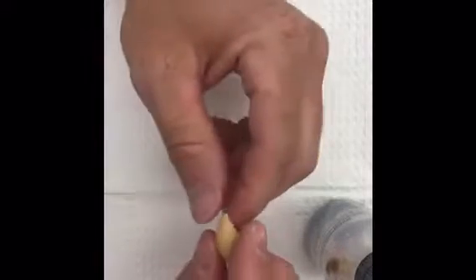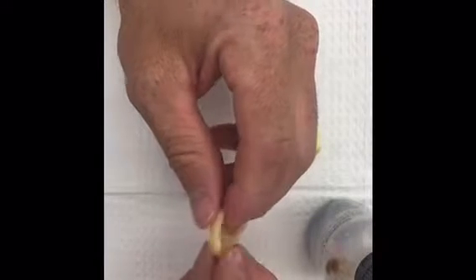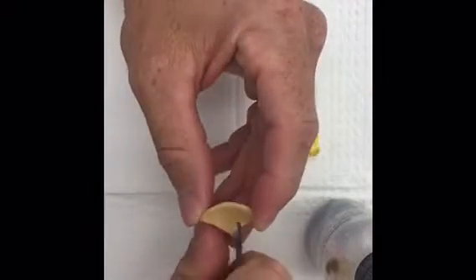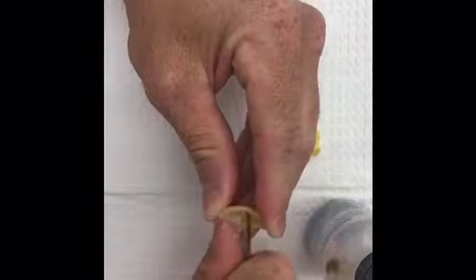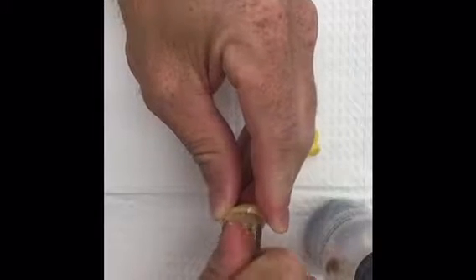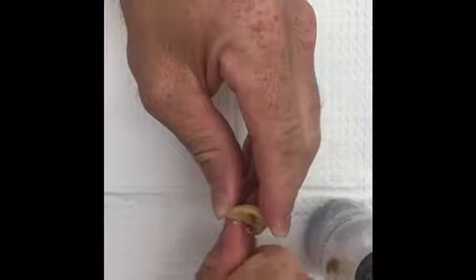I'm hoping this one works — it's the largest one and also the thinnest. The tissue inside looks pretty soft so it should conform to the prosthesis itself. I'm using my wax tool to carve away material because I want it to be thin down here at the bottom — that'll help it stay in. Removing material from the posterior here will also help it stay in.